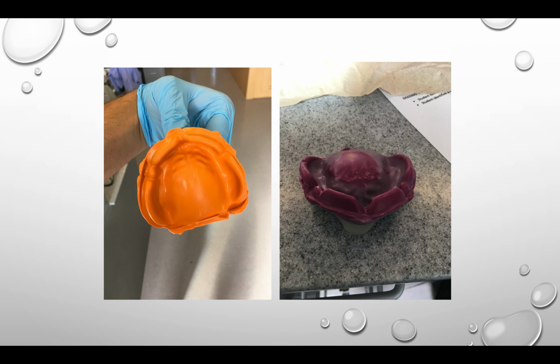Have the patient open their mouth to the maximum, and then have the patient close the mouth about halfway. Have the patient move the jaw side to side and forward to back. Mark your vibrating line, the line that separates the hard palate from the soft palate, using the blue ink to avoid including the temporalis tendon and other movable tissues. If the final denture includes these movable tissues, the denture will not hold a seal and will dislodge easily. Have the patient say "ah" to determine location of posterior palatal seal and movable tissue.